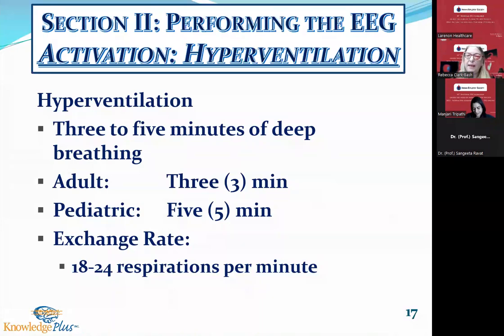Now, the reason I like to put HV after photic is my next goal is going to be sleep. I want them to go to sleep. So hyperventilation is an amazing tool to facilitate sleep. So if I did hyperventilation, drowsy patient, then I did photic, wide awake, I'm probably not going to get sleep on that patient. So with hyperventilation, if you ever awaken in the middle of the night and you can't get back to sleep, I guarantee you, if you do 3 minutes and watch the clock, it's a long time, you will fall asleep. It's magic. And that's not the goal of HV.